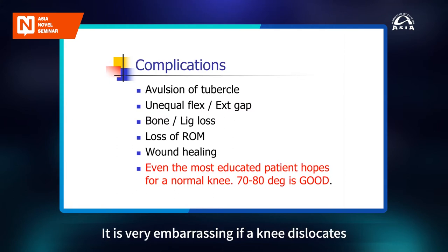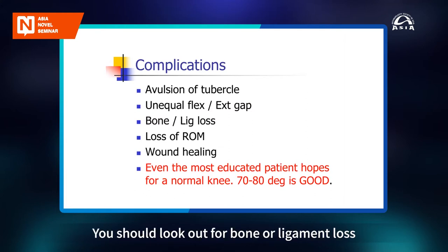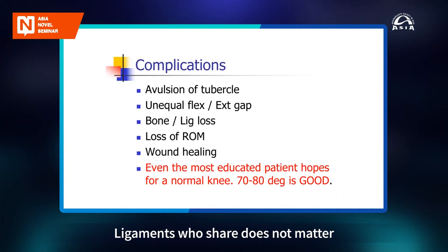It's very embarrassing if a knee dislocates. Today, it should not happen. You should look out for bone or ligament loss. Ligaments, cruciates, doesn't matter because you can substitute with implants.